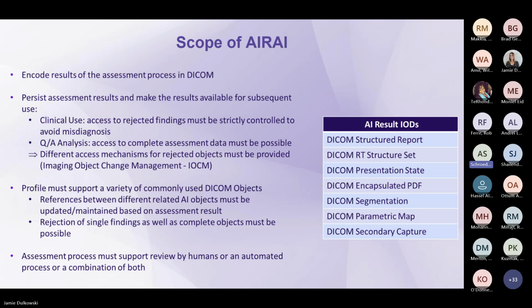But we also have DICOM objects, like a secondary capture, where the whole object itself is the AI result, where we cannot necessarily evaluate each and any single annotation that is burnt into the secondary capture. But we want to make sure that we can support both of these types.